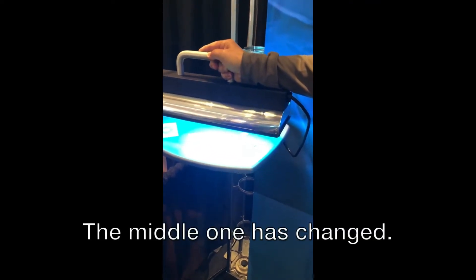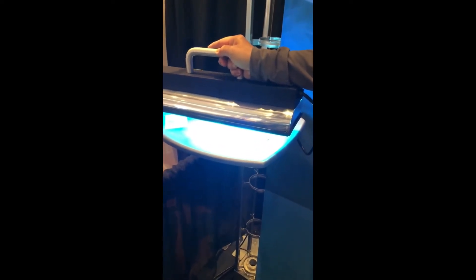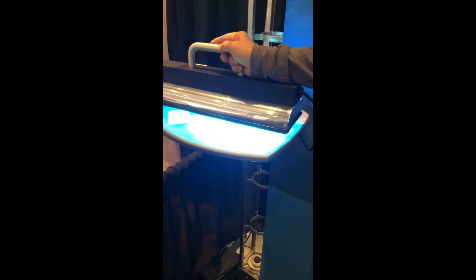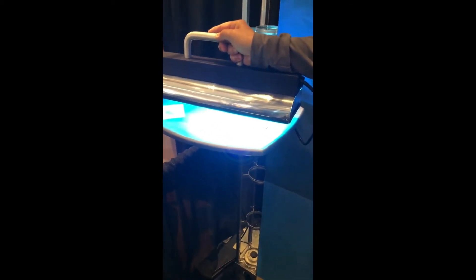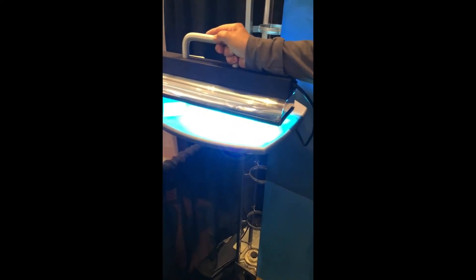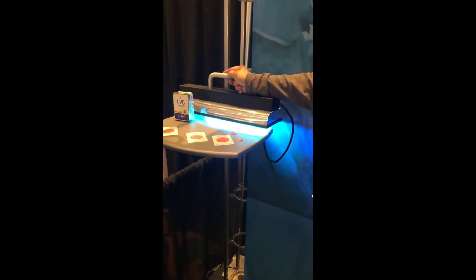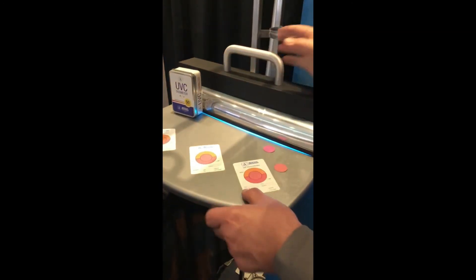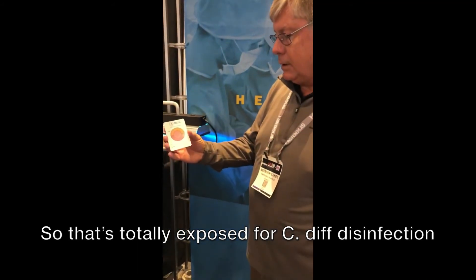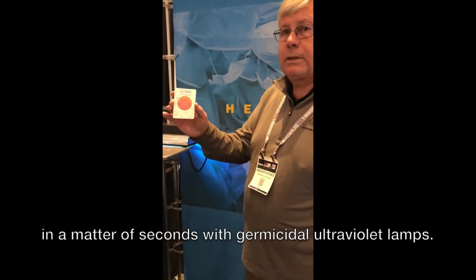And see the middle one's changed. I don't think the other one's changed, did it? So that's totally exposed for C. diff disinfection in a matter of seconds with germicidal ultraviolet.